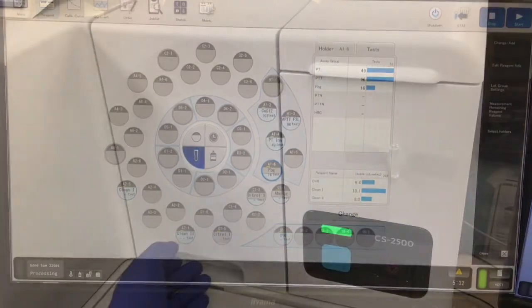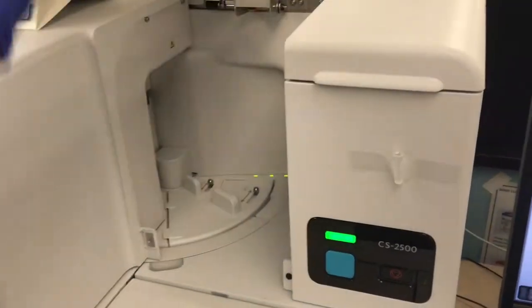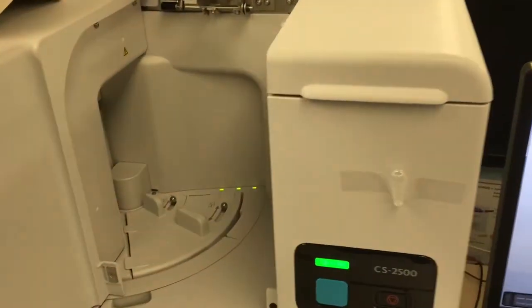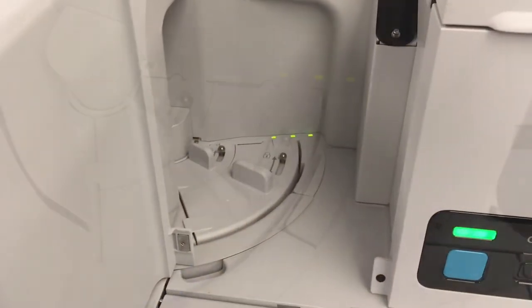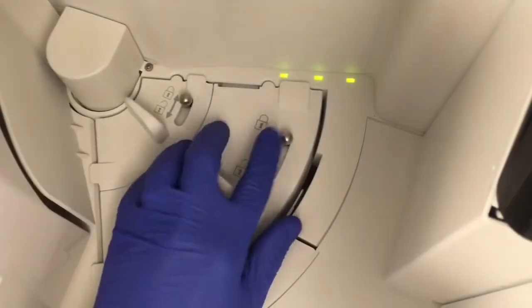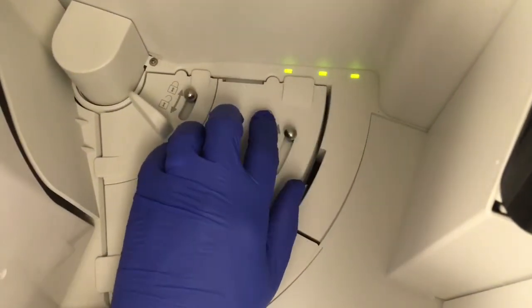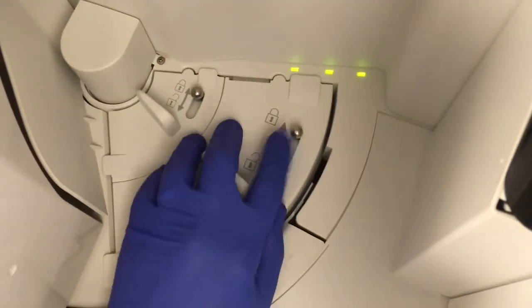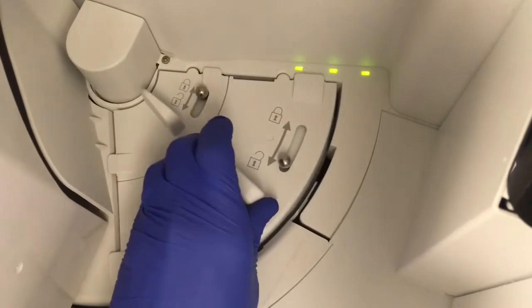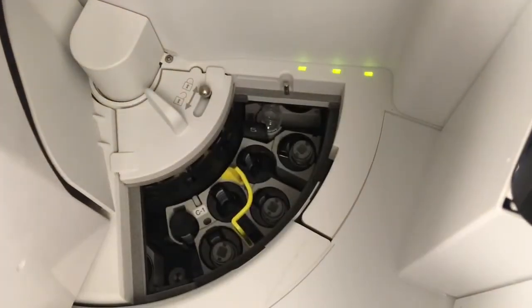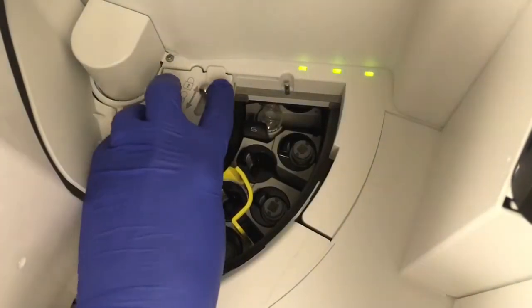Once ready to be removed, open the top cover. You'll see where the reagent covers are, and you want to wait until the green lights are solid and not flashing any longer. Then you can go ahead and remove the appropriate reagent covers.